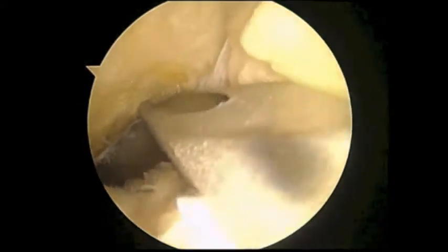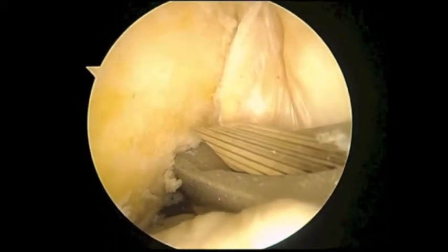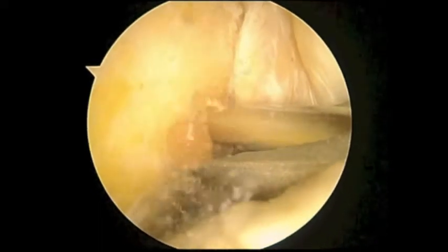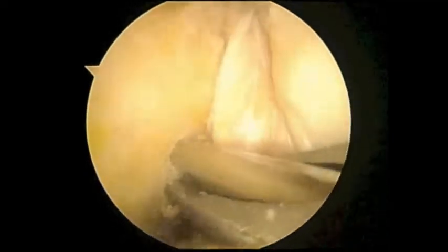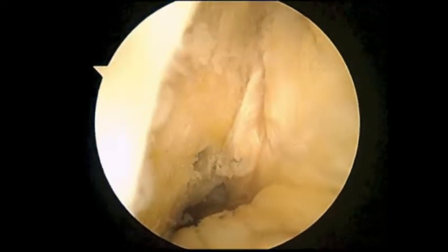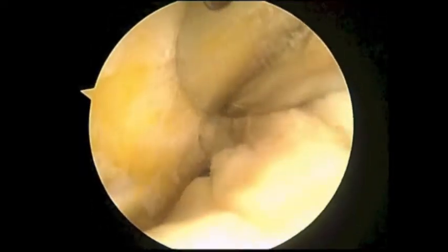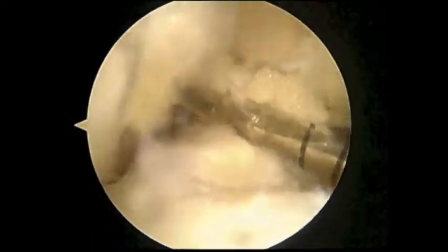We're positioning one of our drill guides to put this graft. We're going to drill a tunnel on the end of the thigh bone called the femur. You can see our guide pin going in. We're going to pull that guide pin through and take a look through one of our other cannula portals. This is to really ensure that we've got that drill point all the way in the back of the knee where it's supposed to be.